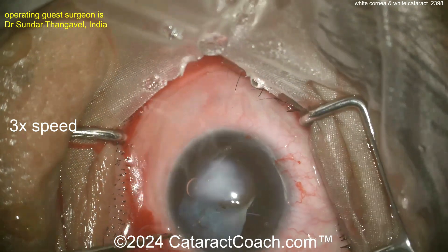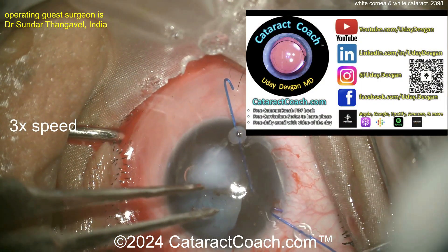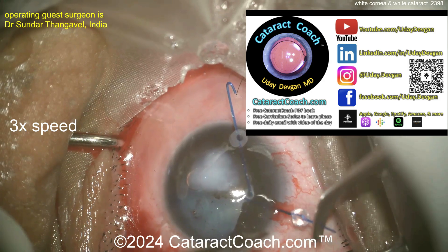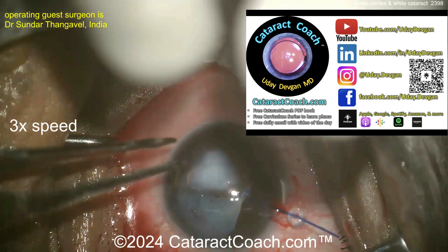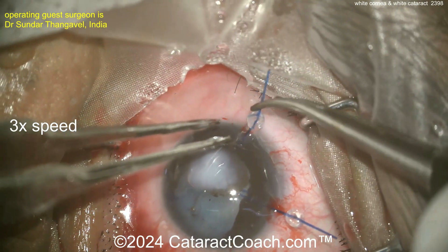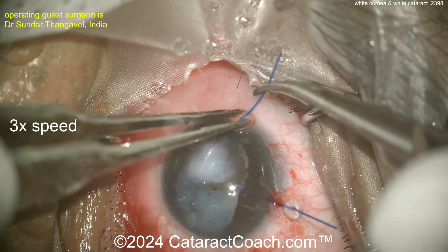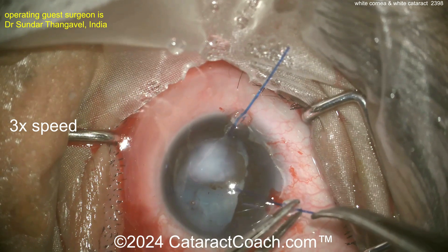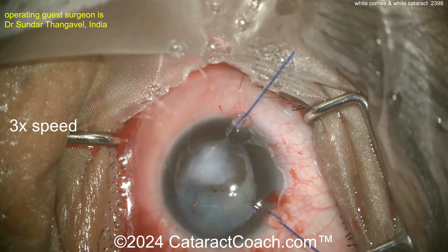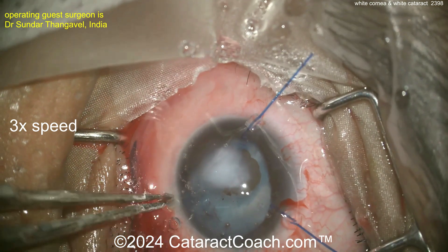Why would you do just the cataract surgery instead of the corneal transplant too? Remember, not everywhere can you get donor corneas. There are the iris hooks. You may not be able to get tissue for a corneal transplant around the world. Plus, this patient has a white cataract — what if you just fix the cataract and see what vision the patient recovers? If it's sufficient, you're done. Maybe the patient has been seeing out of this eye with the corneal scar and actually sees decently. So you may do it in a stepwise approach or just do the cataract surgery alone.